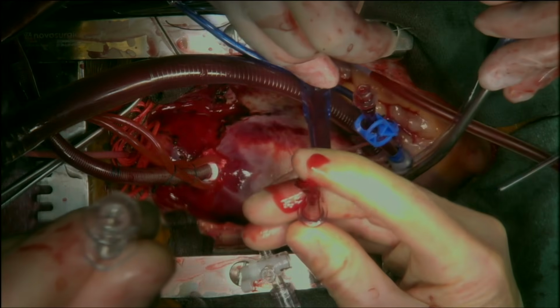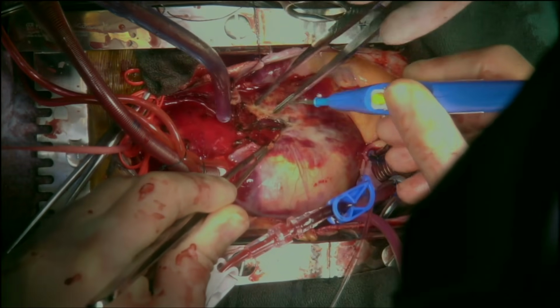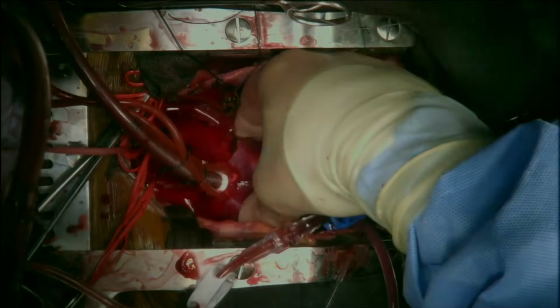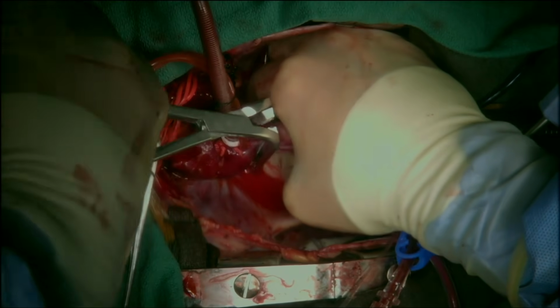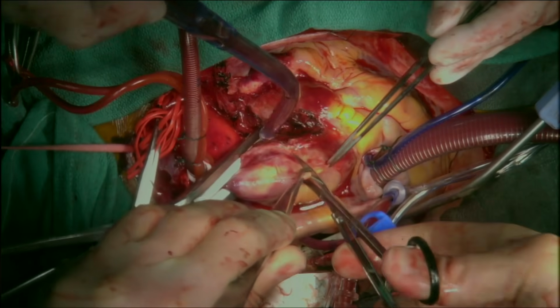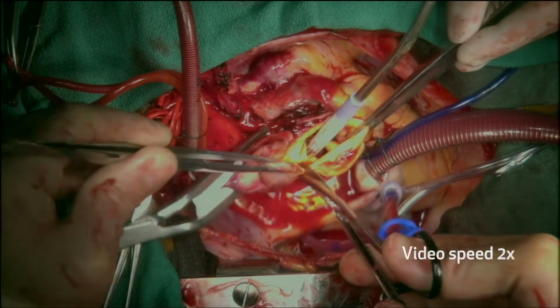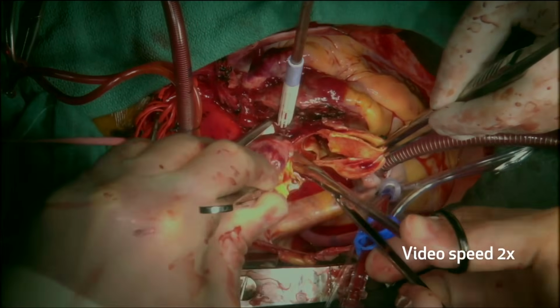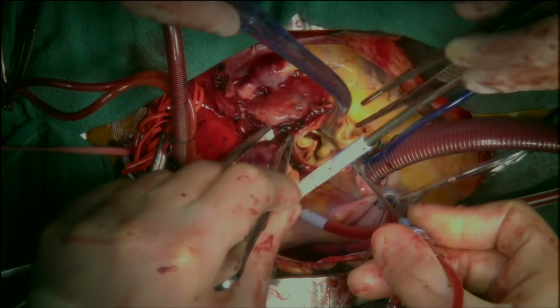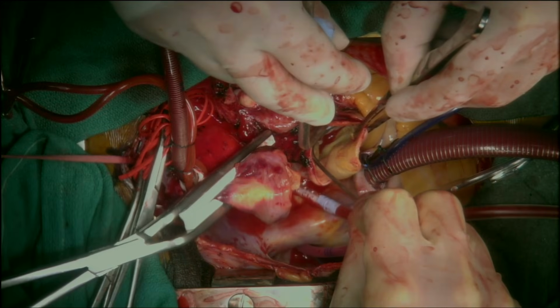The right femoral arterial line pressure did not improve with true lumen perfusion. Thus, this was upsized to a 6 French sheath for perfusion of the right leg using a branch off of the ACP line. The patient was cooled to 24 degrees centigrade. The aorta was cross-clamped while administering retrograde cardioplegia. The aorta was transected. Direct ostial cardioplegia was administered down the left and right coronary arteries.